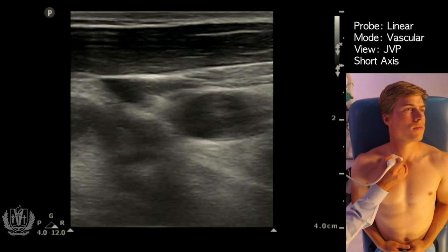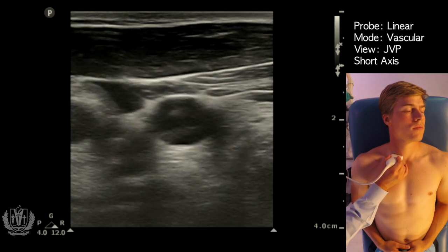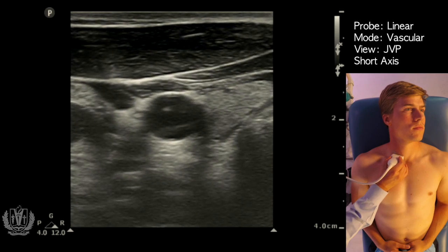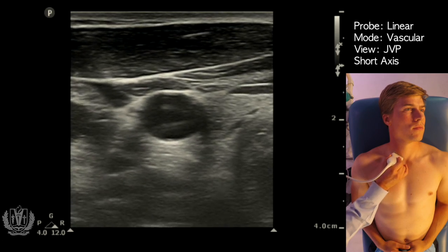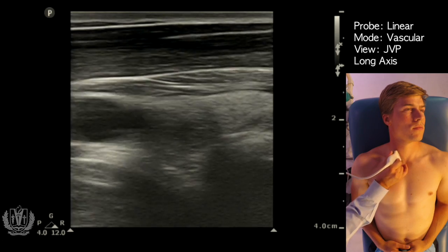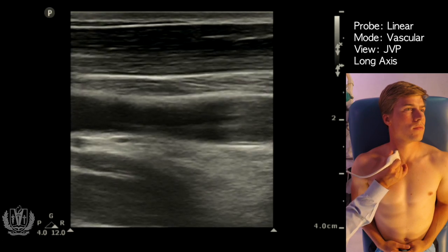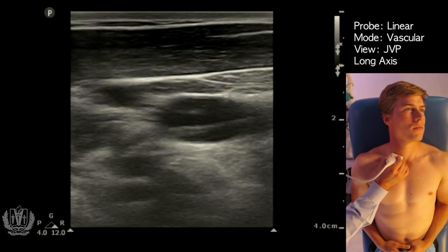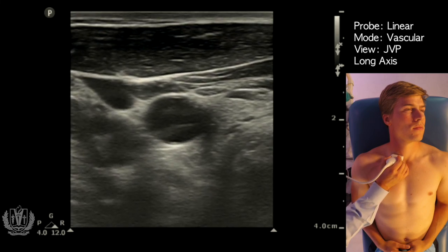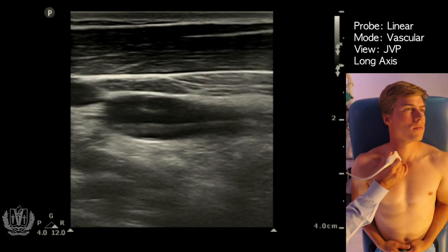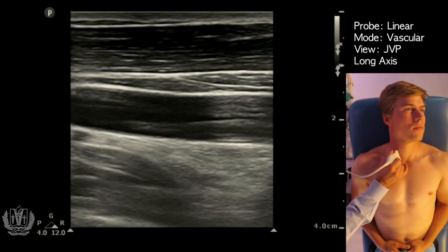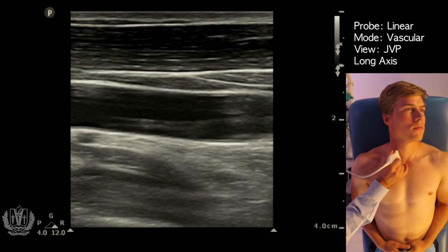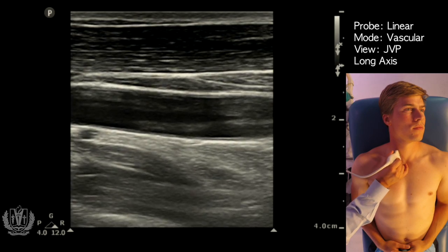You can assess these vessels both in short and long axis. This is a short axis of the common carotid artery, and here is the long axis. I centered the artery and then rotated 90 degrees to get this long axis view.